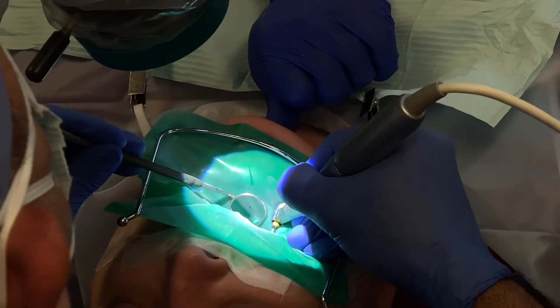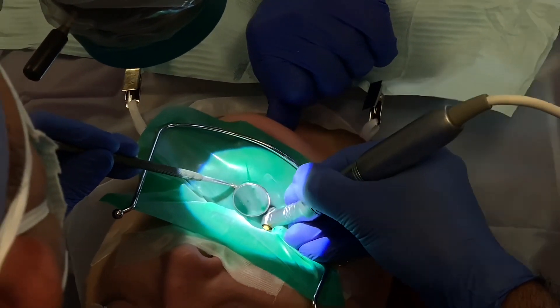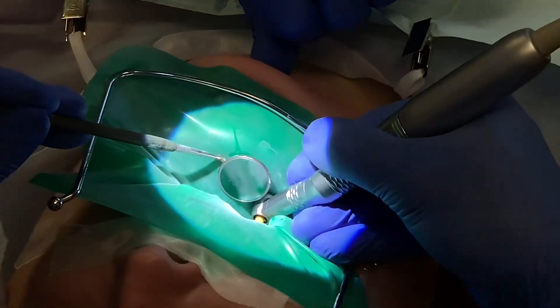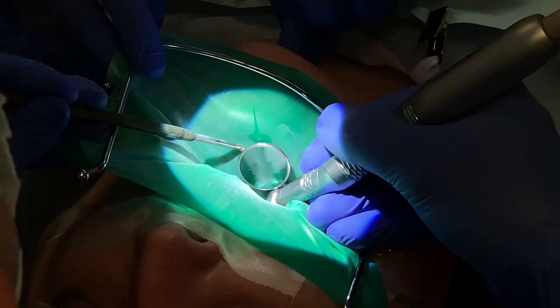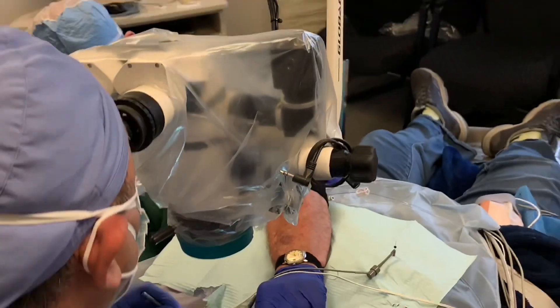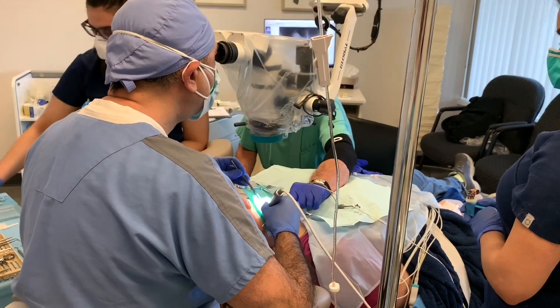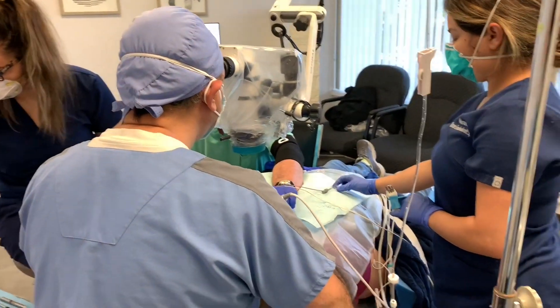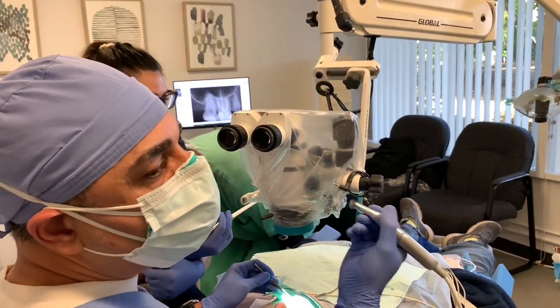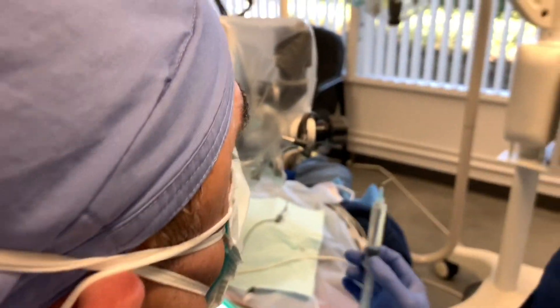The chelating agent goes in. Next, I'm using my flare file to flare the coronal to middle two-thirds of the root canal. The instrument is just a tool — it doesn't ledge, it doesn't perforate; that's the operator. With flare file number 20, I'm already 60% done with instrumentation and shaping.